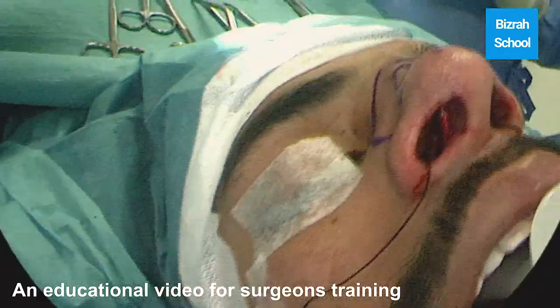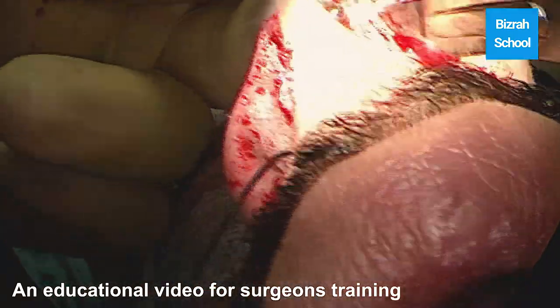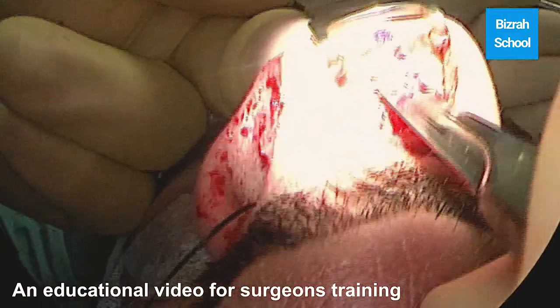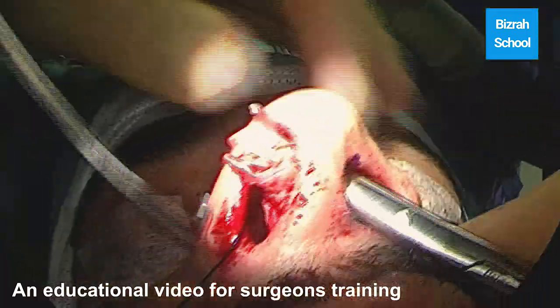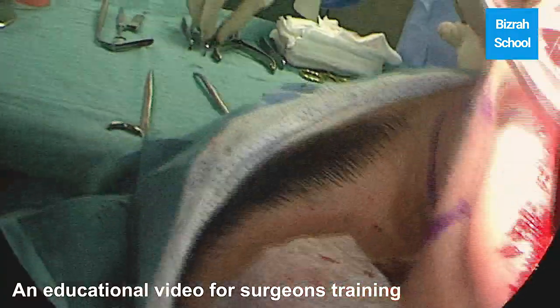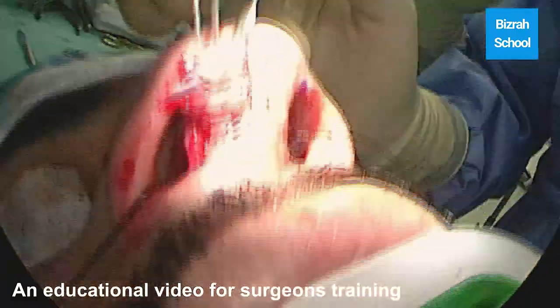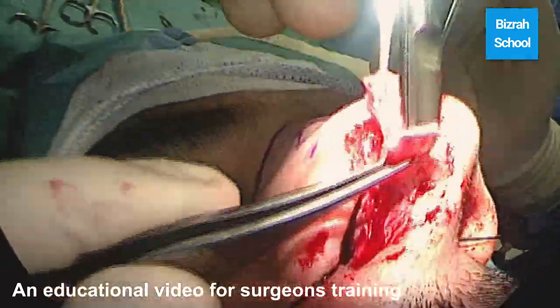Now we deal with the tip. So at the junction between the intermediate and medial crura we divide obliquely, preserving the rim cartilage. Junction between intermediate and lateral crura — we divide obliquely, preserving the rim cartilage. We deliver both intermediate crura and parts of the medial crura to one side, preserving fully the lateral crura. The lateral crura is left in place — no marginal incision, no delivery, and no trimming. In order to support the tip and to create a new dome, we just make a pocket in between the two intermediate crura.